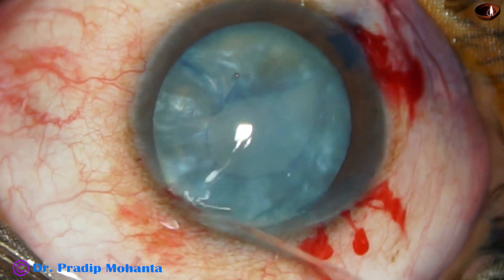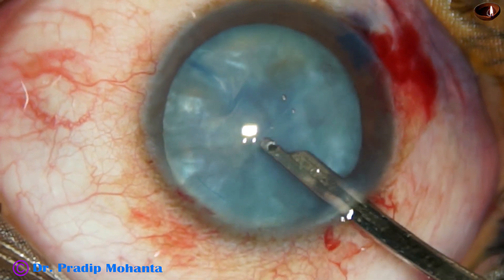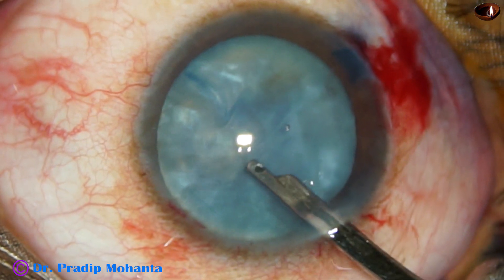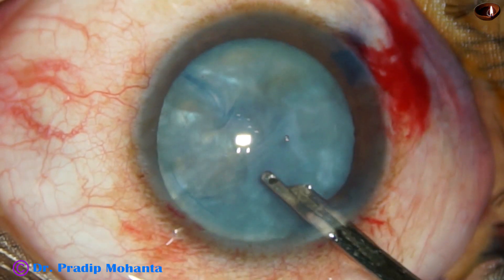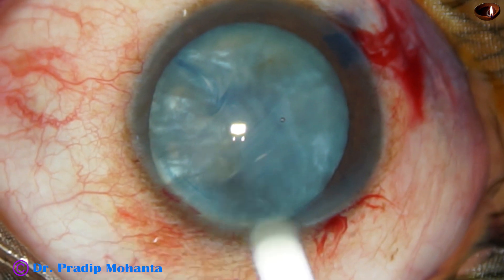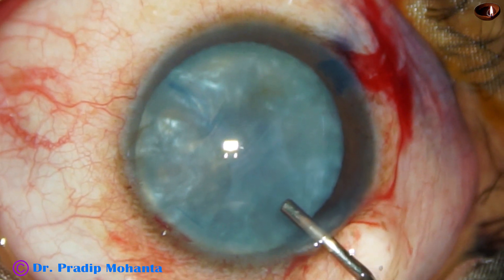In such cases, the fluid can be aspirated without a mini-rhexis. The Argentine flag sign does not occur in this case because there is fibrosis along the way. So the viscoelastic is again used to fill up the anterior chamber.